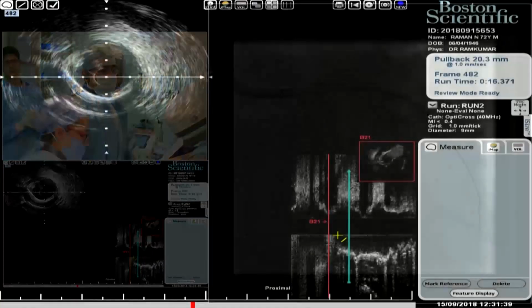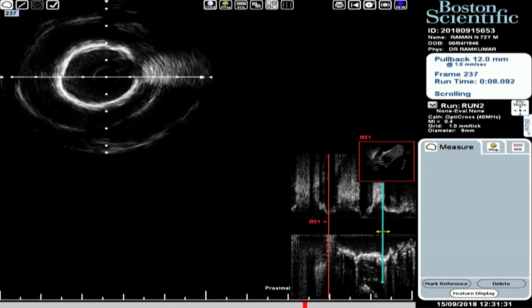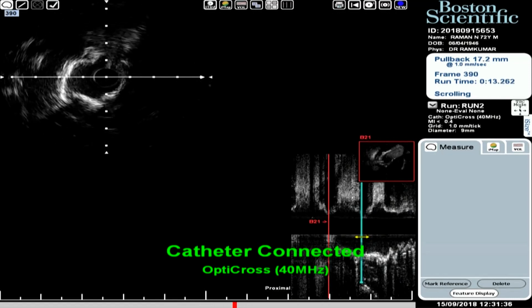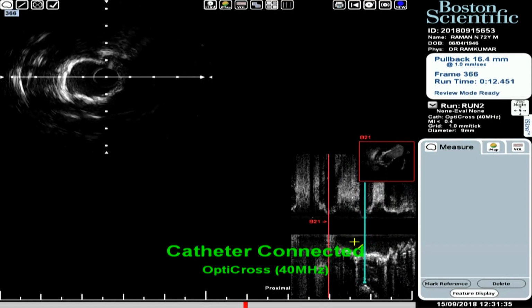I'm not very sure. It looks like we have created some more cracks. The tightest part, you can just see at 7 o'clock. Can you see that? There's a crack. Stent ready. So we'll see how the stent expands. I don't think we can dilate more than this. Maybe we can go up with one more OPN balloon, but it is already.